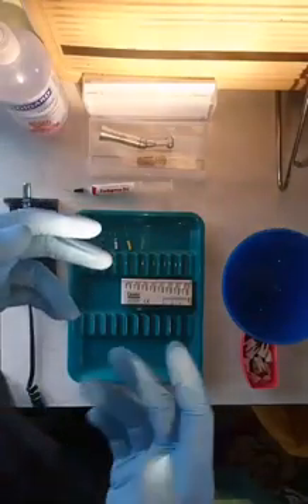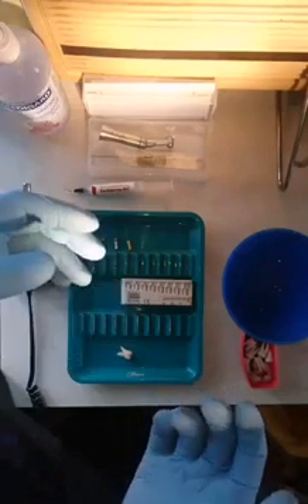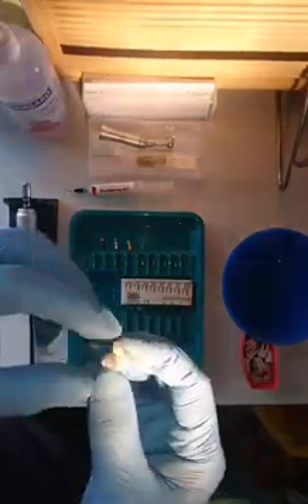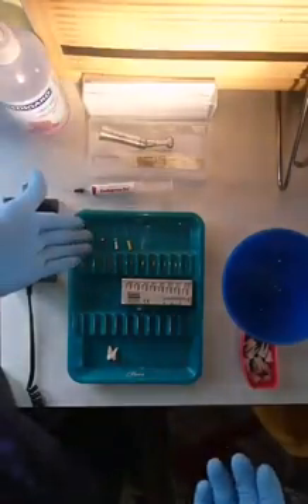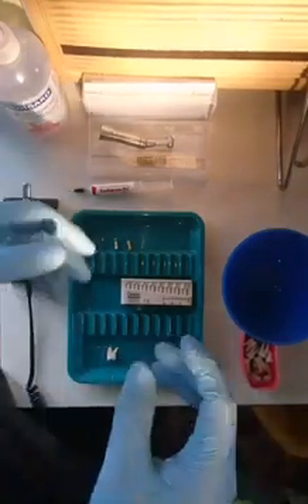This video is taken to explain how a glide path can easily be achieved for a root canal treatment. What we have here is an upper molar with three roots. An access has been prepared, and as simple as it may be, we have three files — just your normal hand files.